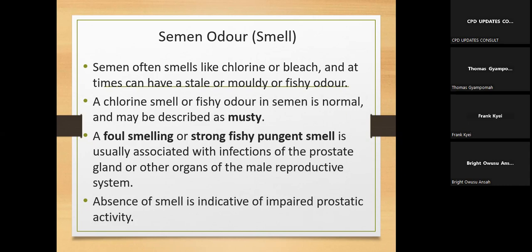The prostatic secretion smells of bleach. So if the specimen does not smell of anything, you could also begin to suspect that there could be a prostatic issue.